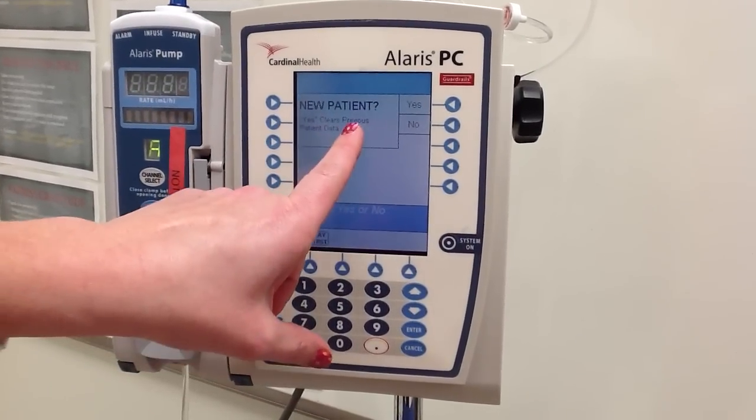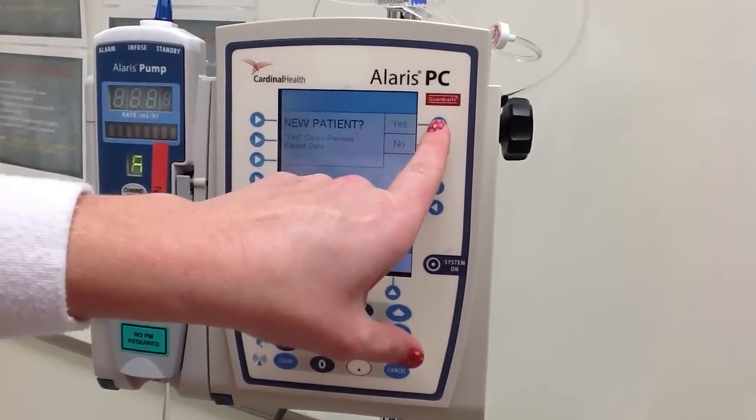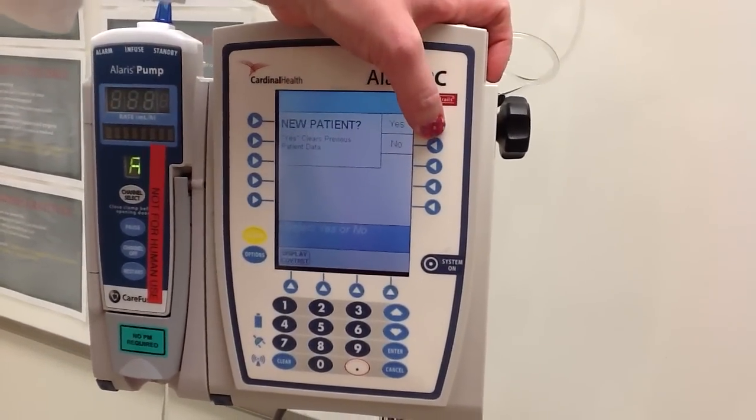It's going to ask you: is this a new patient, or is this a previous patient? For our purposes, we are going to say yes, this is a new patient.